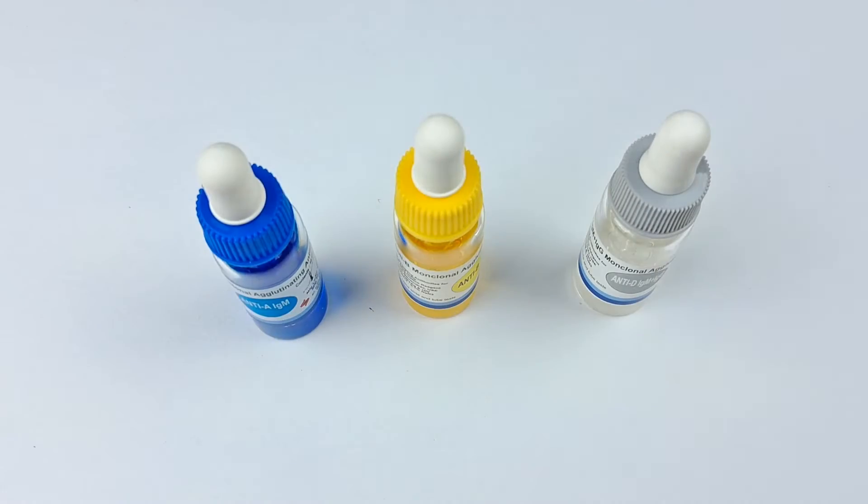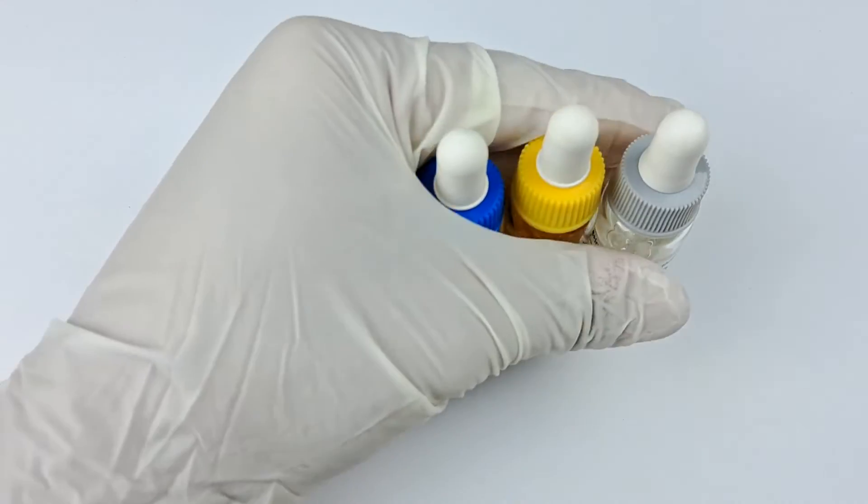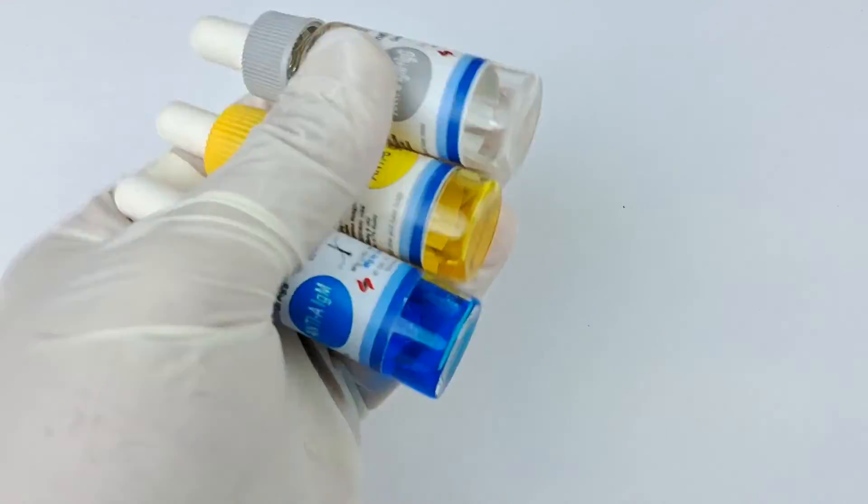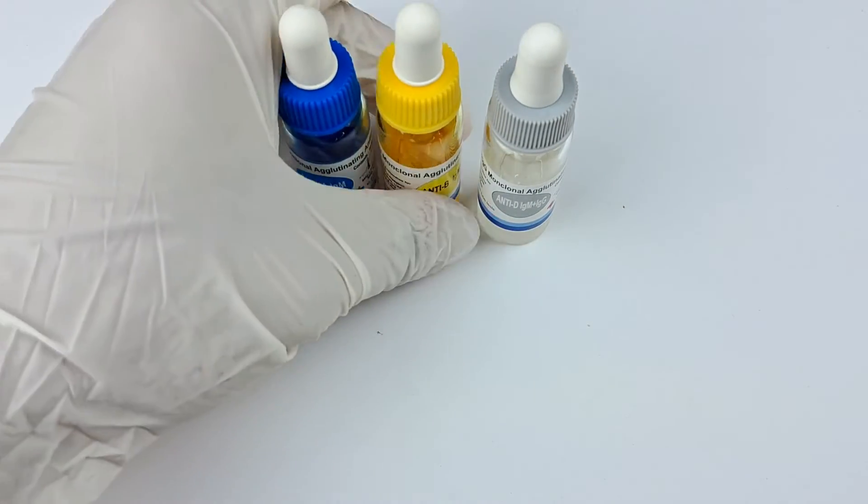Homogenize the contents of the antisera antibody vials by inverting each bottle three to five times and allow them to equilibrate to room temperature.